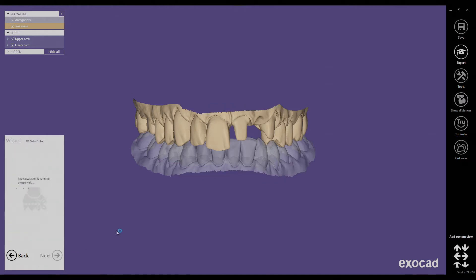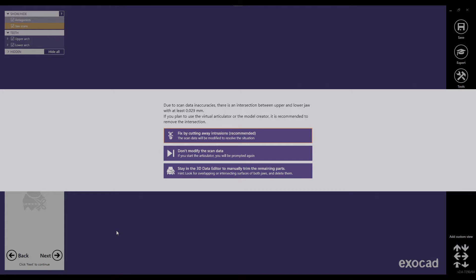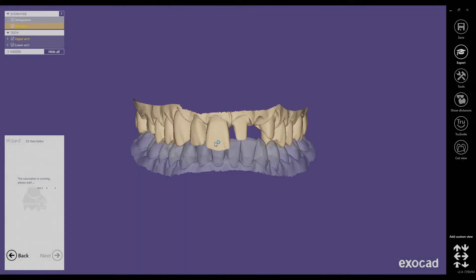We click on next, and now Exocut is proposing to remove the intersections between both models. These intersections are quite minimal so I am okay with removing them, though you could also keep them and do this adjustment manually in the articulator later. I am going to choose automatic adjustment — intersections will be removed on the upper jaw by default.